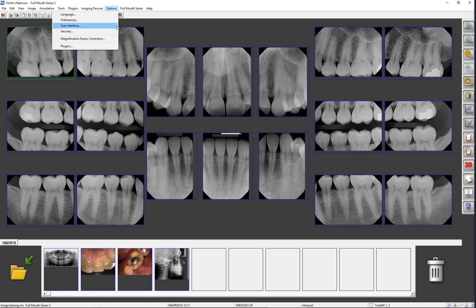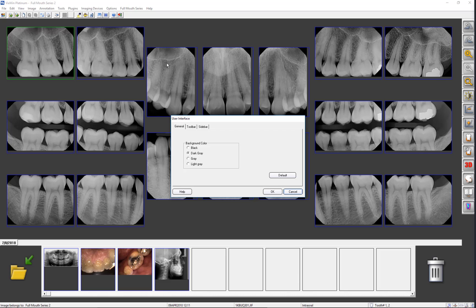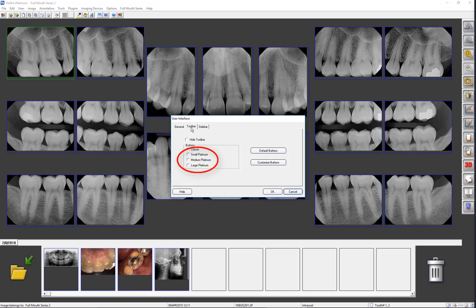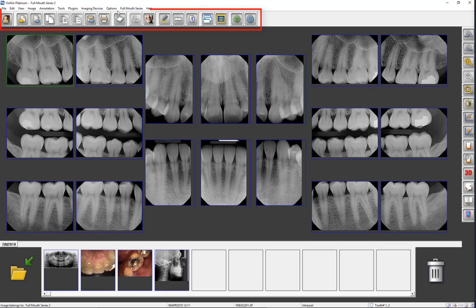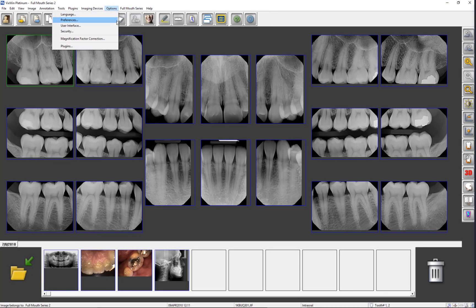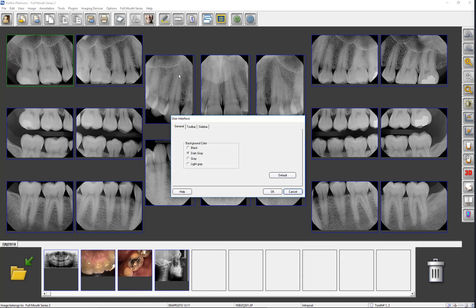Also, the size of the toolbar can be changed by selecting Small, Medium, or Large Platinum. When the software reopens, the size of the toolbar and the buttons will have changed. Small Platinum is recommended for monitor resolutions of 800x600, Medium for resolutions of 1024x768, and Large for resolutions of 1280x1024, 1600x1200, or touchscreen monitors.